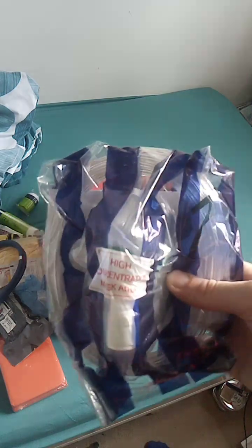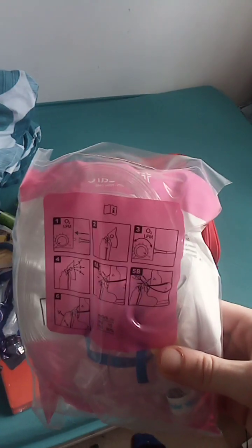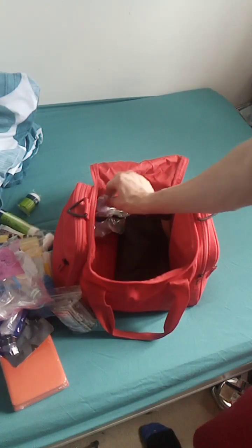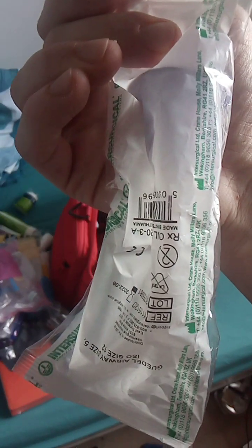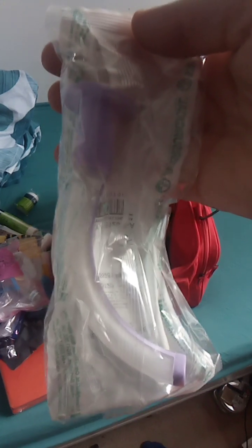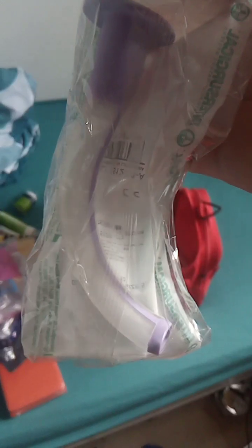Oxygen mask - connects into an oxygen tank. I carry an adult one and a paediatric one. And an airway tube - it's for your airway, just an airway tube for your mouth. So when the airway is blocked and you can't open it by doing the chin lift or the jaw thrust, you put one of these down. Or if a doctor puts them to sleep at roadside, he'll put one of them down so you can control the breathing.